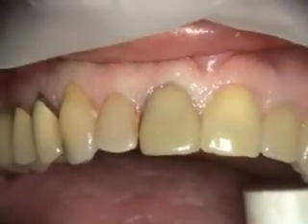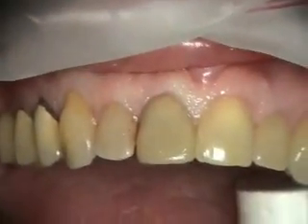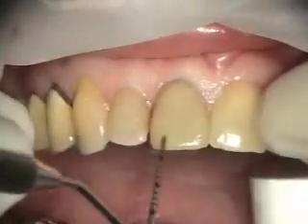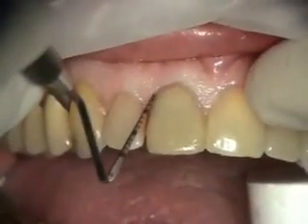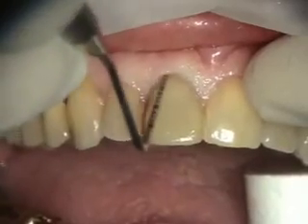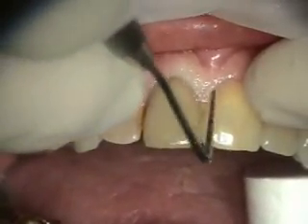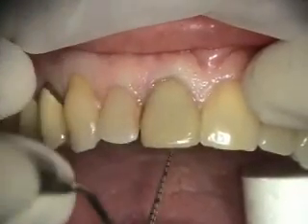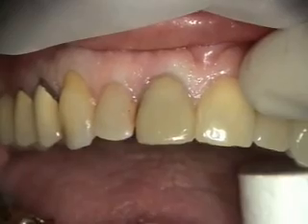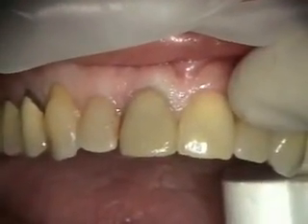Today we're dealing with tooth number eight. Tooth number eight is fractured and right now she's got a bonded composite temporary, but she's got pocketing and it's fractured. The good thing is that she's got a nice thick periodontium. She does have a pretty large root, though, so we're going to be removing this tooth, putting in an implant, and doing an immediate provisional.